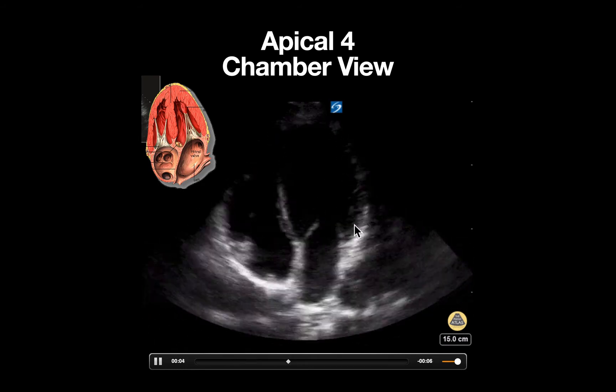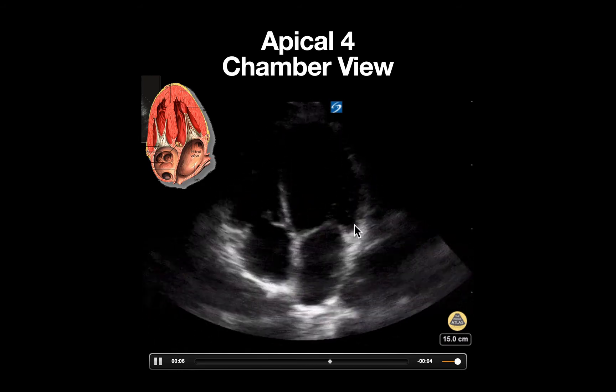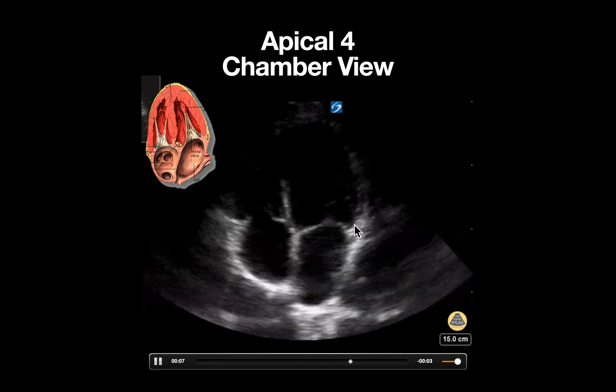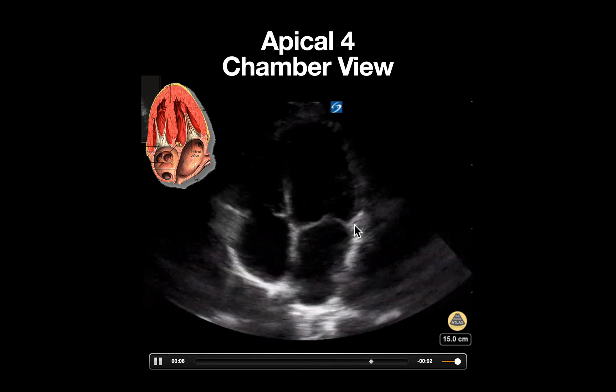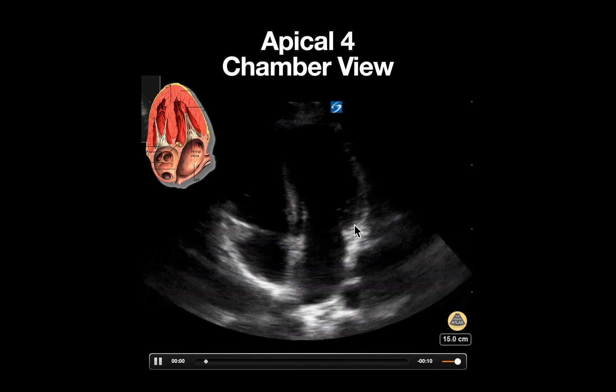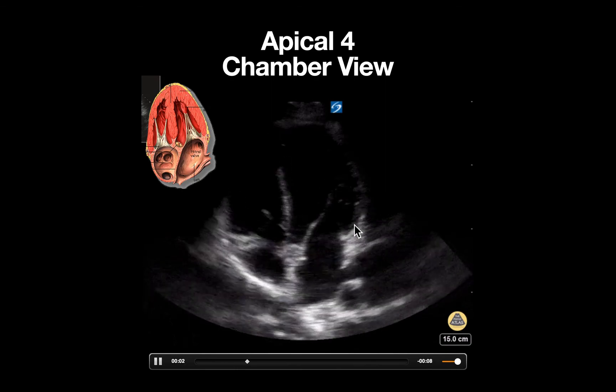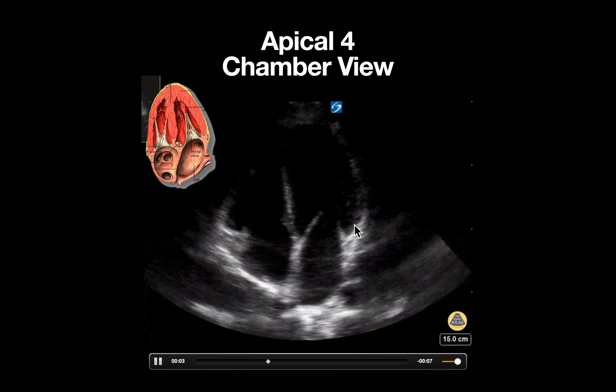The apical four chamber view is an excellent longitudinal section of the heart that allows comparisons of the ventricular size, as well as chamber contractility and presence of pericardial effusion.